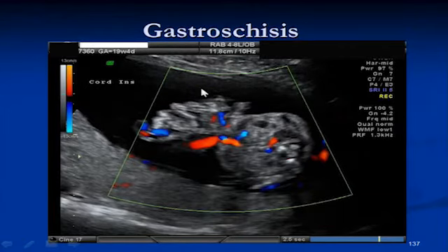So remember the four features: normal cord insertion, the lesion is para-umbilical, no covering membrane, no liver herniation. Add one more: with gastroschisis, no increased risk of fetal aneuploidy. So now you have 5.